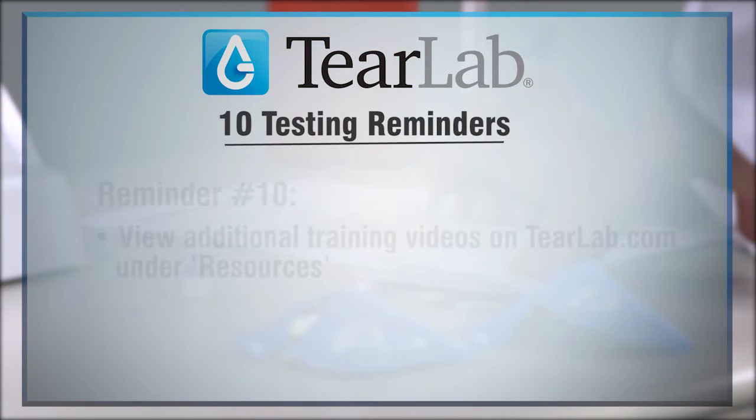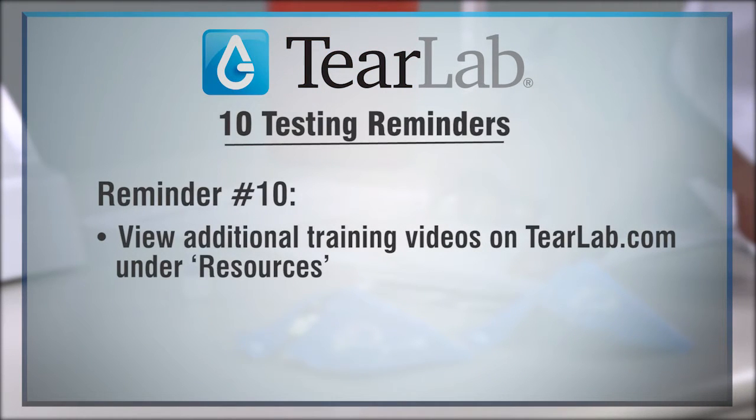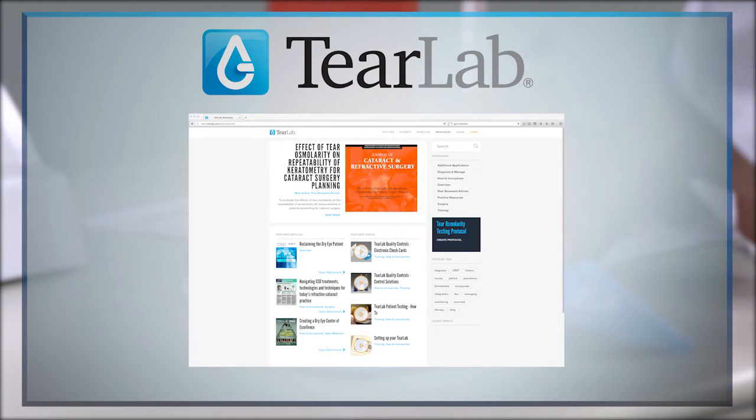Reminder number 10. View additional training videos on TearLab.com under Resources. There you will find additional training videos such as how to test, quality control solutions, electronic check cards, and more.